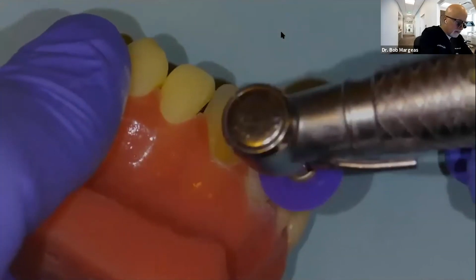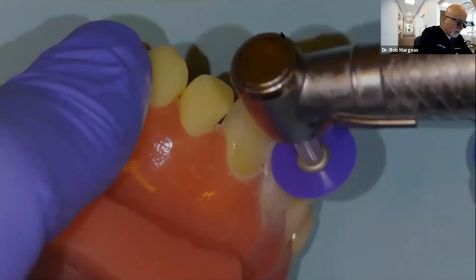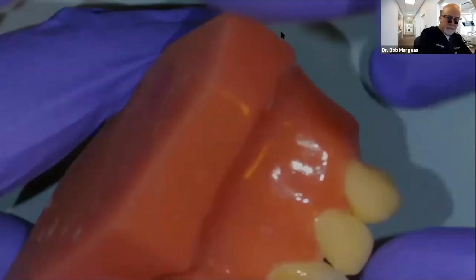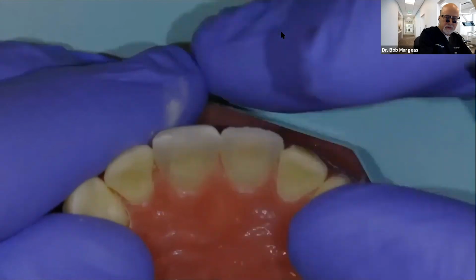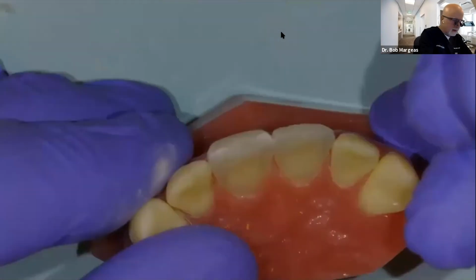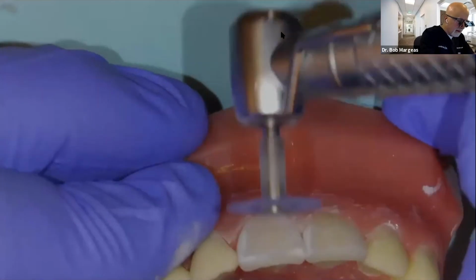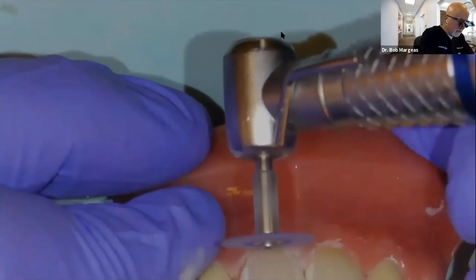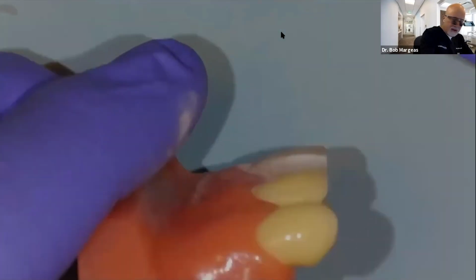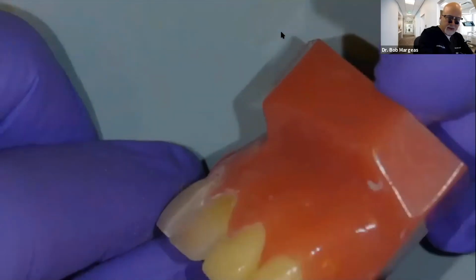A lot of people have never used discs. I could not work without discs. Okay. You can start to see that as I'm bringing this back into the arch alignment, I'm not making the tooth flat. I'm trying to do it in 3 planes, where we have a cervical, a middle, and an incisal. Very similar to what you see here. See how I have that in alignment?